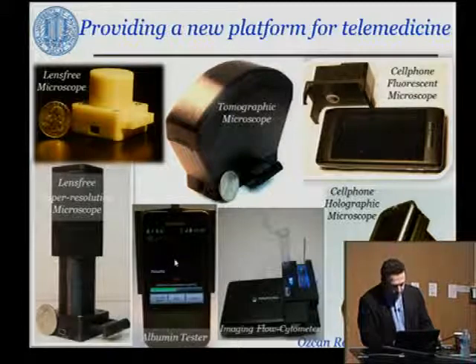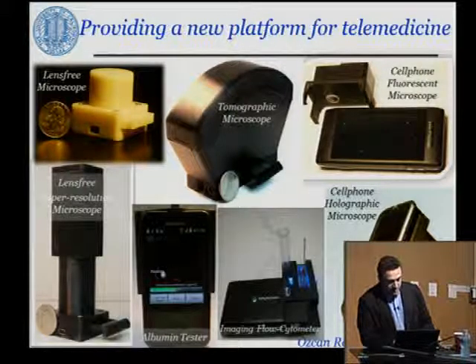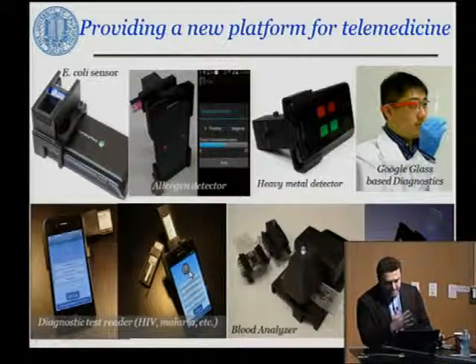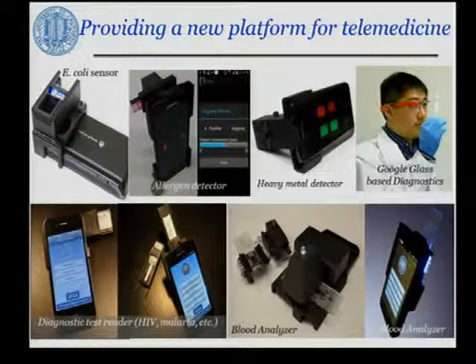In this case, you're looking at an Android phone, which looks at a fluorescent signal from urine samples to quantify albumin, which would be important especially for chronic kidney patients, with about a few parts per million level of sensitivity. And in this next slide, I'll show you some other, maybe a little bit more recent examples, using fluorescence and bright field microscopy through attachments to a mobile phone camera.